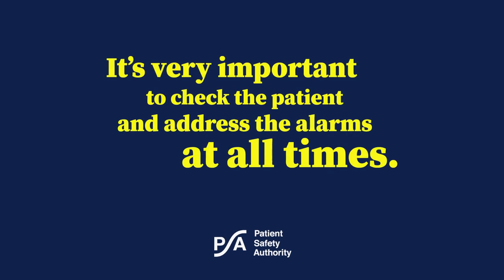Alarm fatigue is real, and nurses and all staff do get desensitized to the monitors, but it's very important to check your patient because you never know when an alarm is going off and a patient is crashing and you need to assist your patient. So it's very important to, like Heather said, check parameters and make sure that the patient has all that they need, but it's also very important to check the patient and to address the alarms at all times.